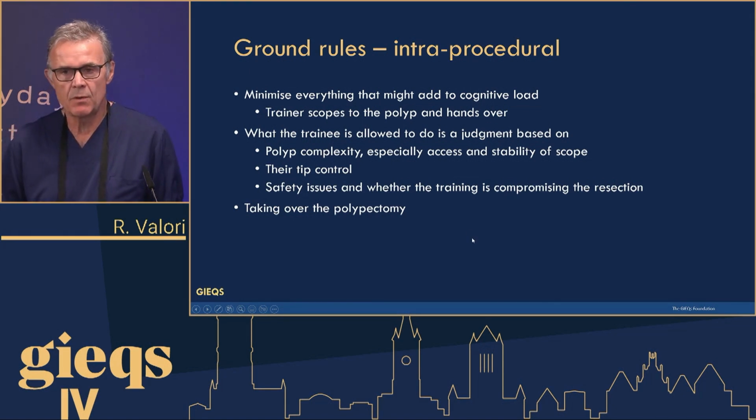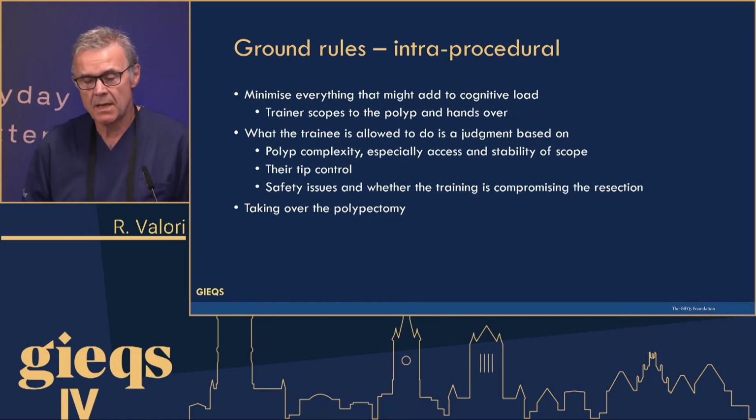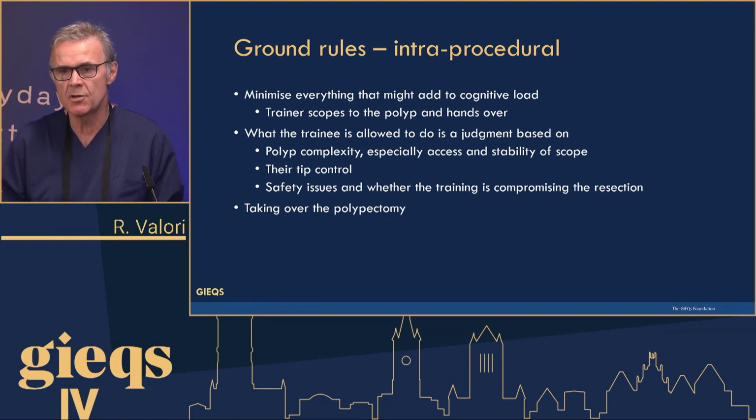Well, we were talking in the safety session just now about cognitive overload being a risk factor for adverse events. And particularly in the early stages of polypectomy, I think everything possible should be removed from the trainee's attention.